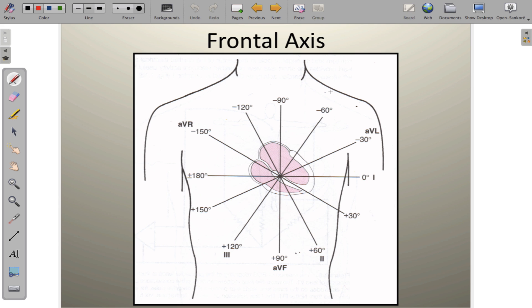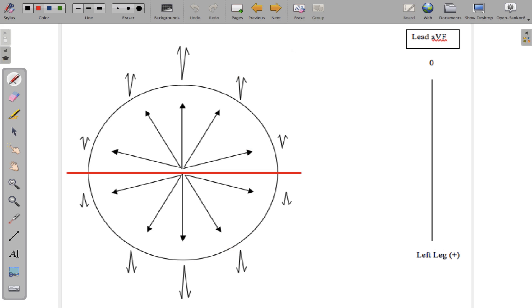When we talk about axis deviation, we're specifically talking about the frontal axis — in the frontal plane. We're looking to see in which direction ventricular tissue is depolarizing. We assign a specific angle to that direction — it's essentially a vector with both direction and magnitude. Leads 1 and AVF allow us to determine that, with lead 1 perfectly horizontal and lead AVF perfectly vertical.